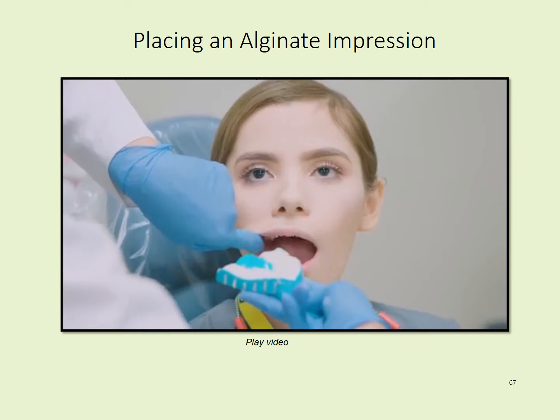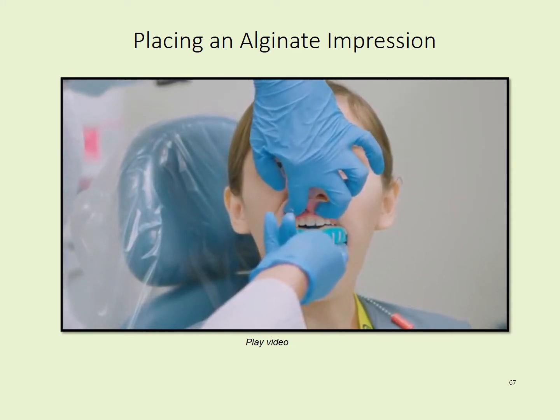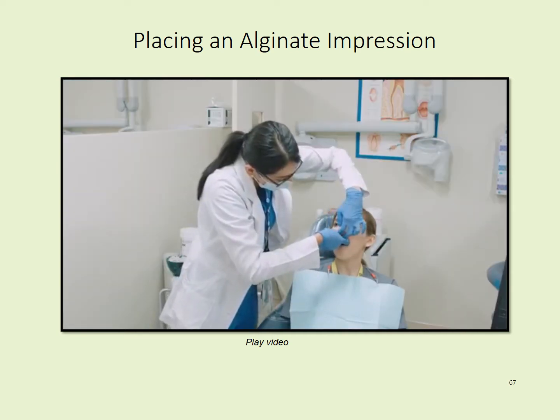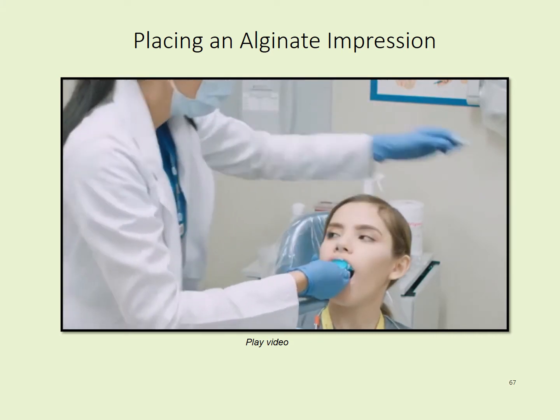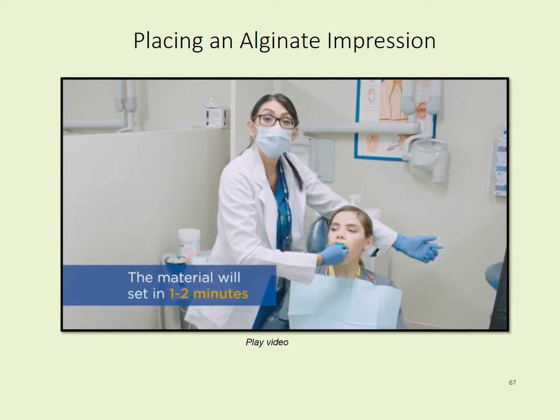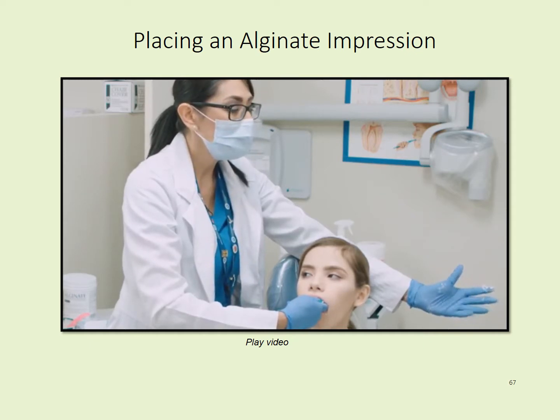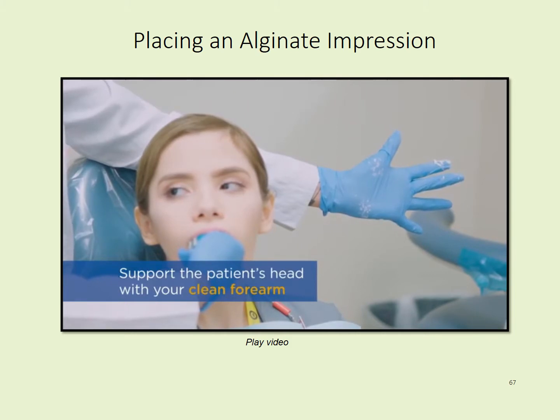All right. Line up the midlines, retract the lip. At this particular point in time, it should take anywhere from 1 to 2 minutes for this alginate impression material to set. And so see my position, this hand over here has alginate material, so it's away from the patient's head, and I'm using my forearm for support.